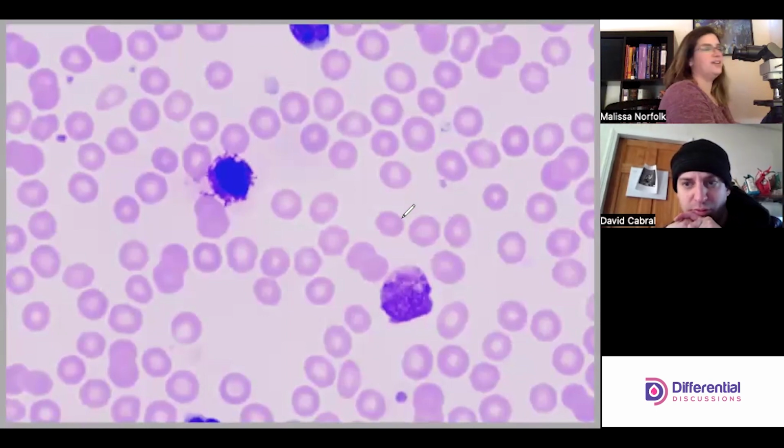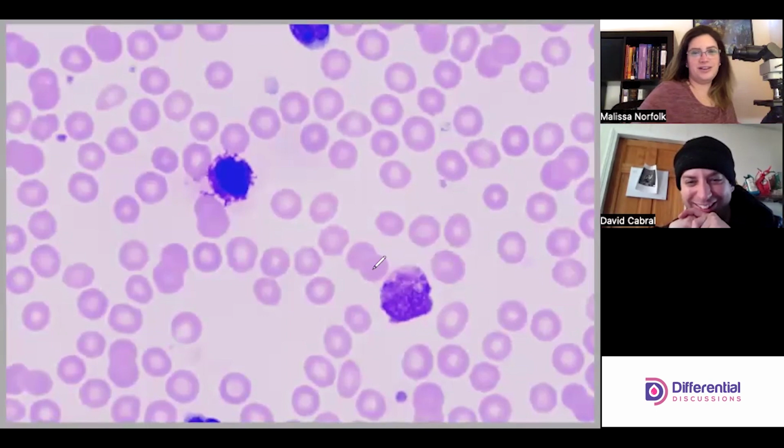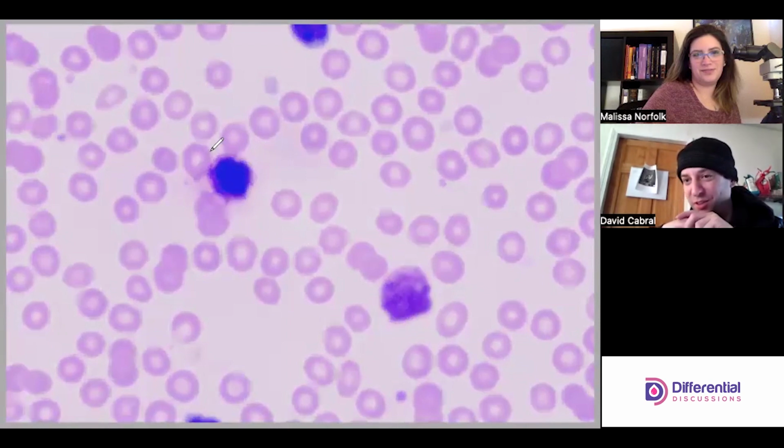It's not in the field. Oh no, it is in the field. There it is, this one. That thing. So it looks very, very dense, the nucleus there.